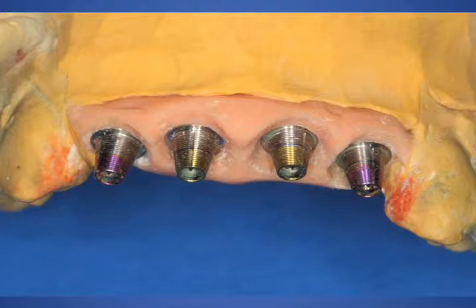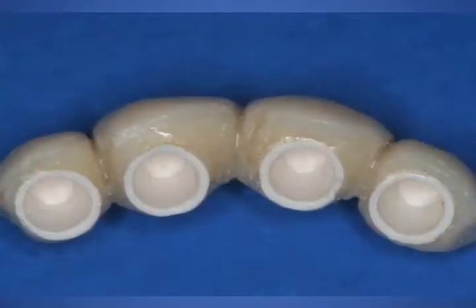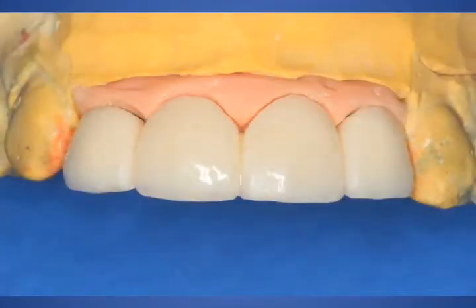They are determining ideal position for ideal final aesthetics of the final crowns. Here the dental laboratory fabricated 4 transitional crowns that were splinted together that would be placed immediately after implant placement, surgical placement, using the surgical guide that we'll illustrate more clearly in a little bit. So the dental laboratory has a very important role in determining final aesthetics. Now, we wanted to use the patient's own natural incisal lines and basic contours in determining length and position as possible with the amount of bone that we had.